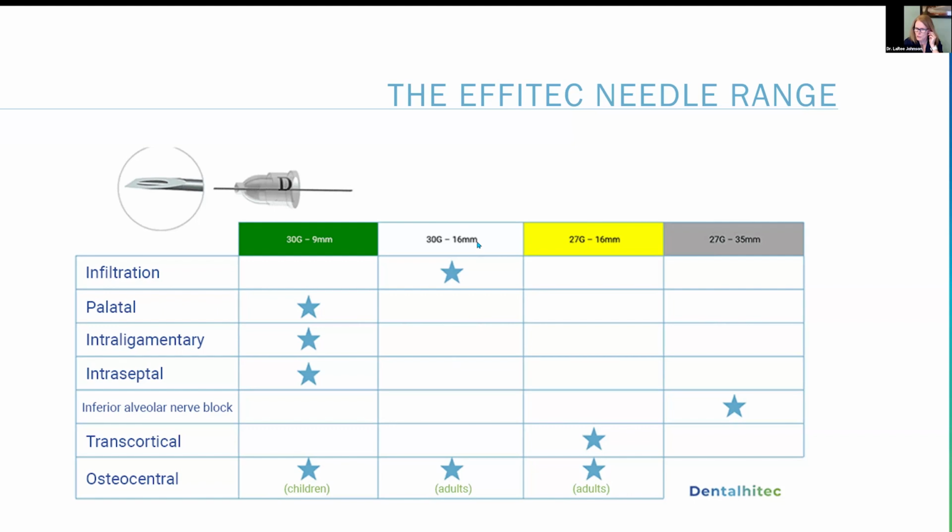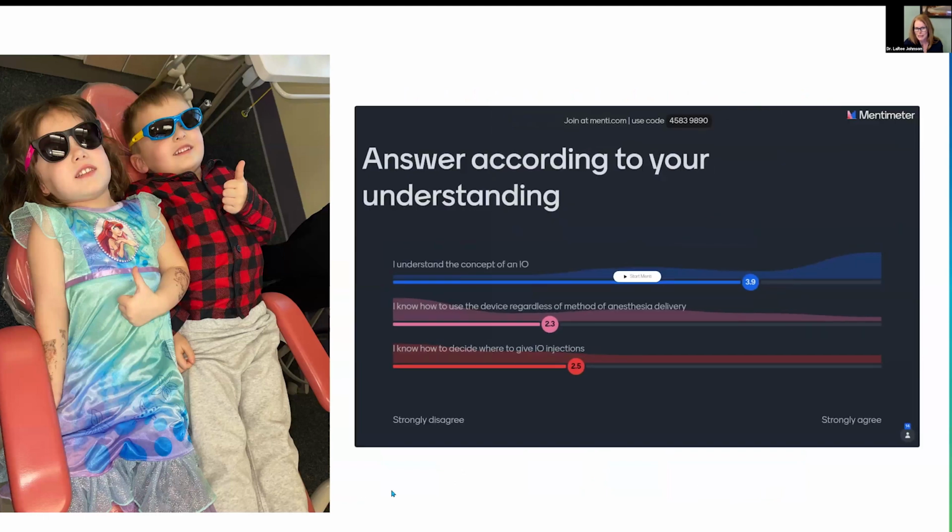And again, you can do this if you're amazing, and I'm sure you're more amazing than I am, but I strongly recommend you stick with the green and just consider it being anesthetizing the tooth, mesial and distal.